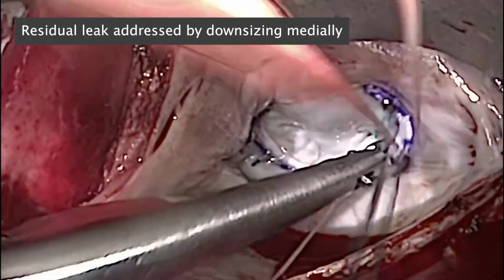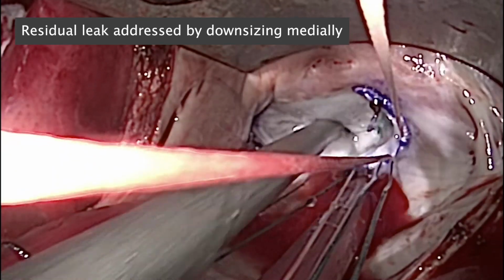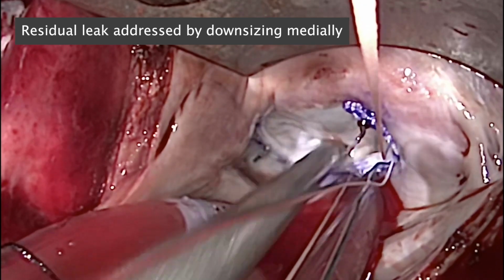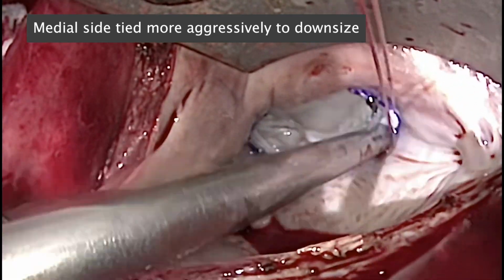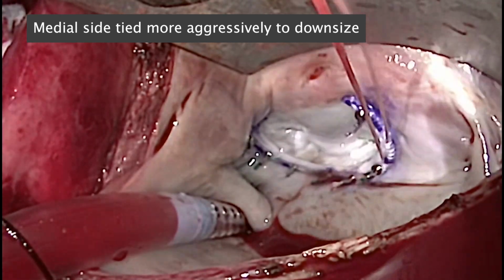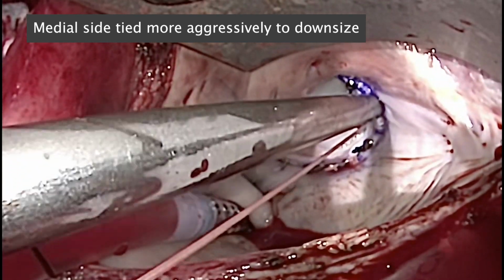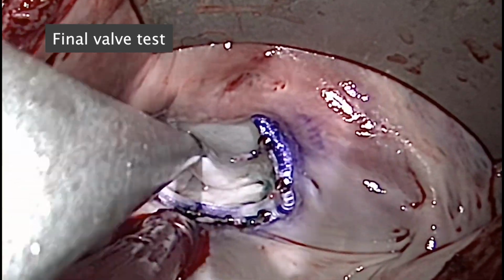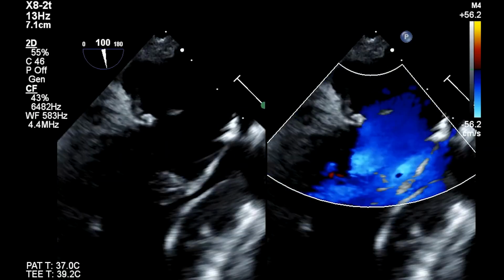We confirm the downsizing. We're going to intentionally downsize the ring more medially by taking the shaper off and then securing more tightly to close the AP diameter. In this way, we're able to tailor the anatomy of the ring or band to the patient. You can see this asymmetric band allows for optimal coaptation.